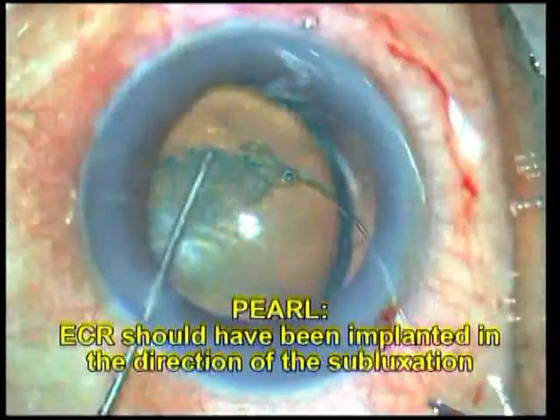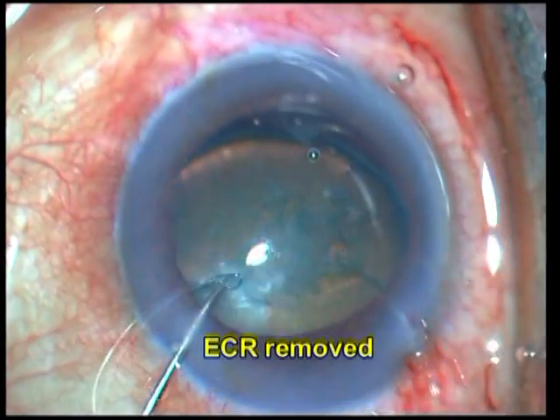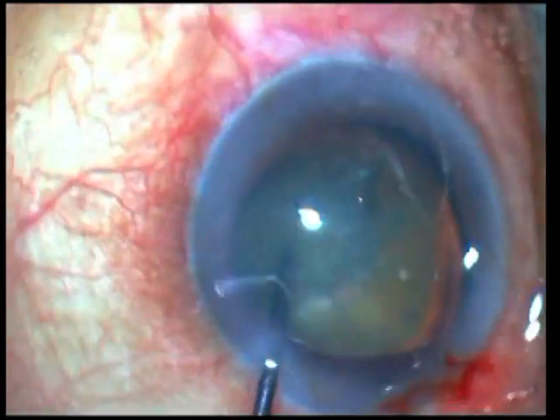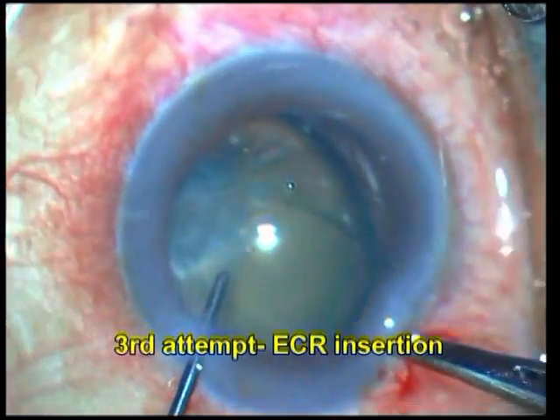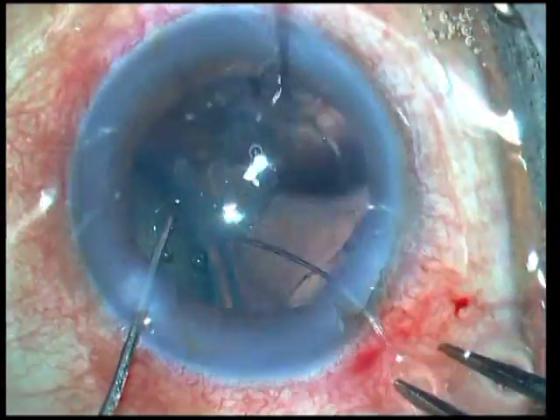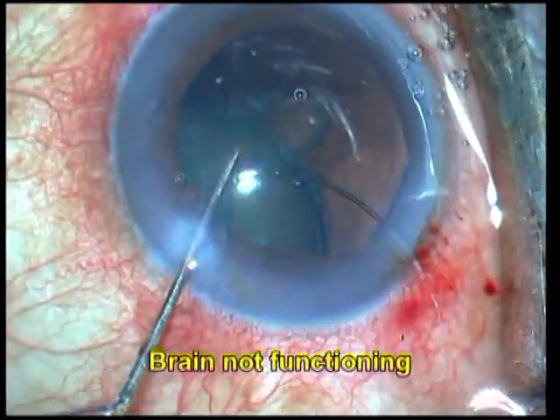In this first case, multiple attempts are being made at implanting the CTR and if you look carefully, you'll notice that it is being implanted in the direction opposite to the zone of dialysis, which means that the CTR is actually pushing the entire capsule and the cataractous lens away and it's actually increasing the zone of dialysis. The attempt is going on being made again and again with no apparent beneficial effect.